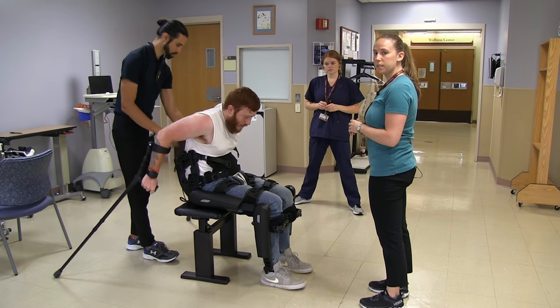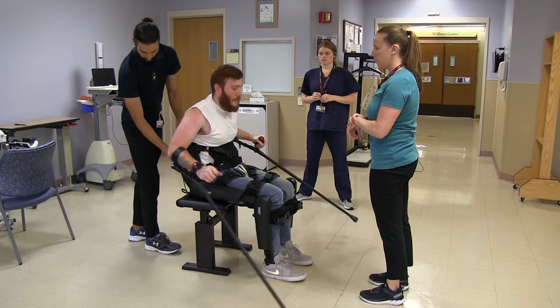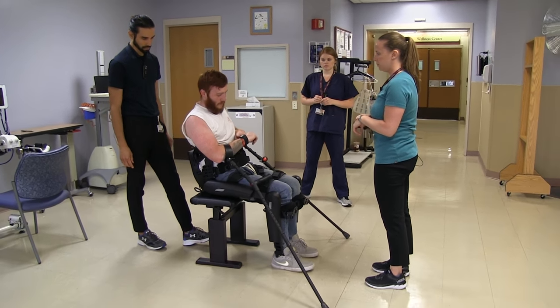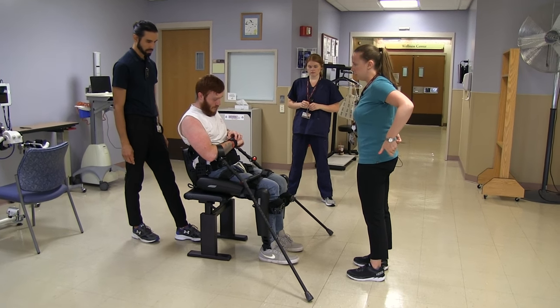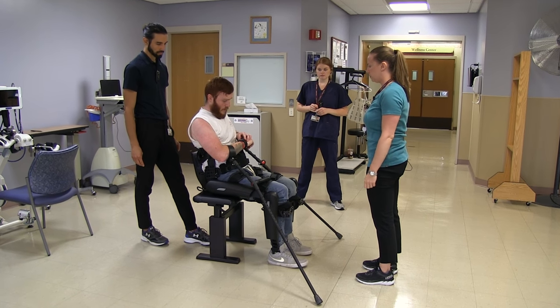When Keith is ready, he's going to do a sit-to-stand. He's going to press the controller on the watch to change it from the sitting position to the standing position. He's going to take both crutches, bring them behind him and tuck them in, then lean forward — and the device is going to help him stand up as he leans forward.